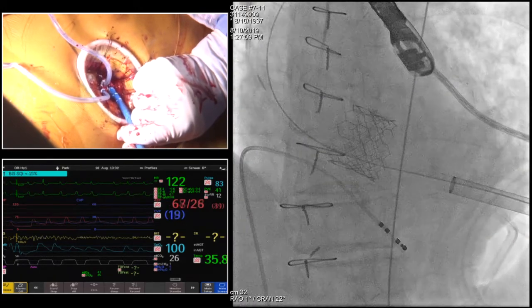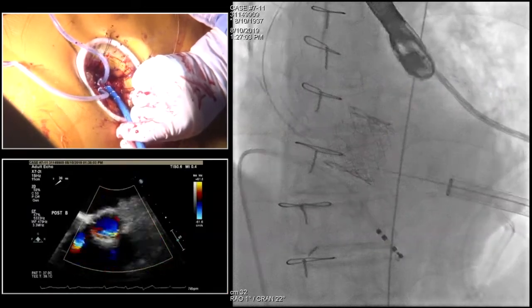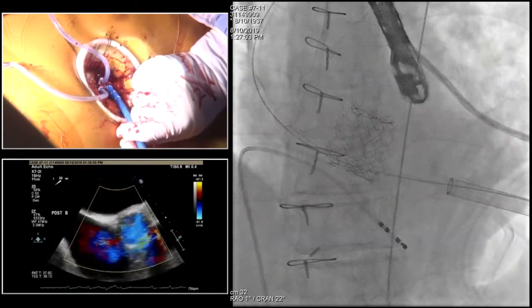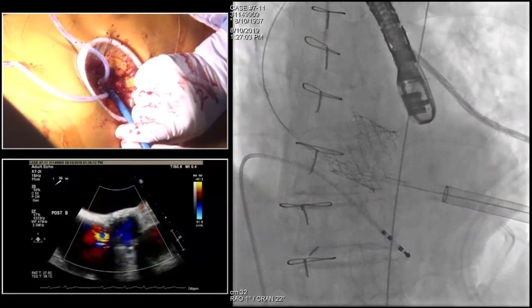I think we need to do a randomized trial of 3 versus 5. In the United States, we do 3 seconds. So. Okay. Yeah, that is very nice, very nice. Yeah. Okay, 1, 2, 3, 1, 2, 3, 1, 2, 3, 됐어. Okay, I think we did everything. In Asan, they sing, you know.